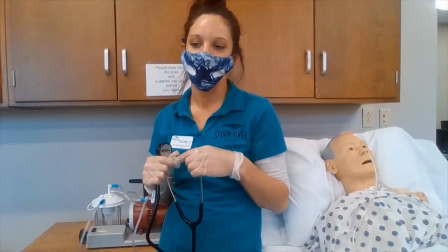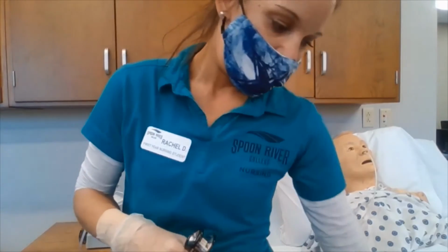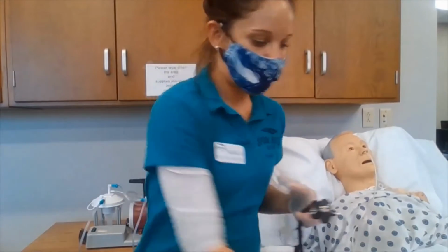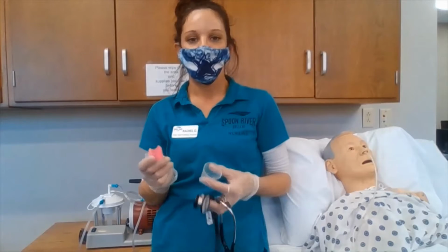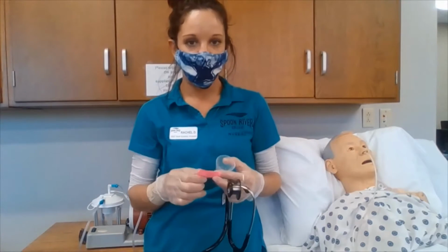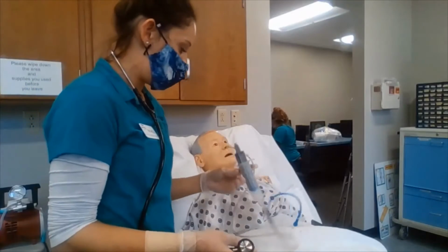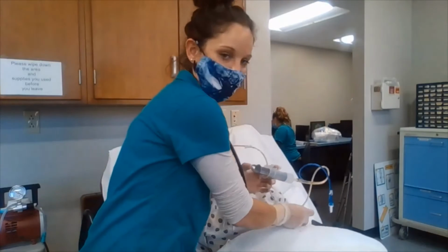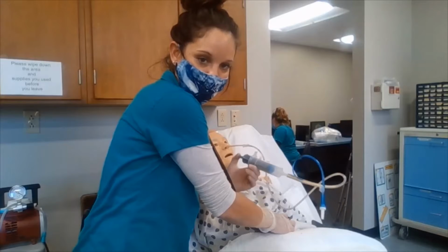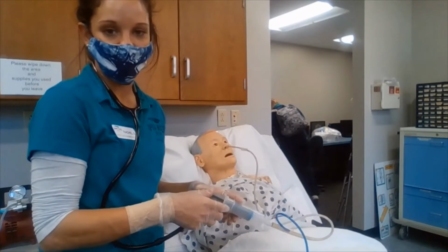We can also inspect the pH, so we can aspirate stomach contents and check with our pH strips. So gastric contents usually are between 1 to 5.5. Another method would be inserting air and auscultating the abdomen to hear which sound. We are also going to ask the patient to speak.